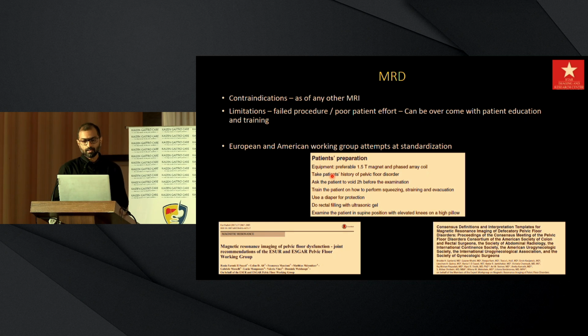So, what about MR defecogram? There are no contraindications per se to an MR defecogram except for standard contraindications for any other MRI. The gross issue with the procedure for me as a radiologist is a failed procedure, because the patient has not been able to comprehend what exactly is to be done and is unable to provide adequate strain while performing the defecation phase. You might not realize this, but sometimes when I tell a patient on an ultrasound table to hold their breath, they are not able to do so. They don't comprehend what exactly they are supposed to do.